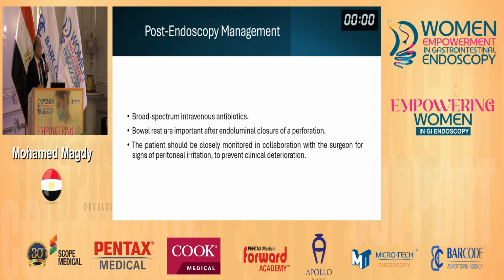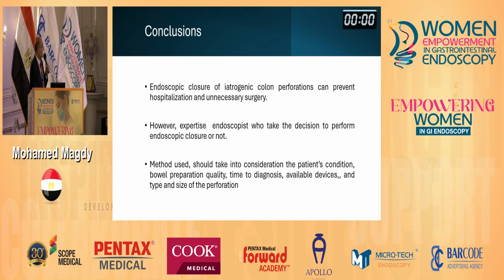Post-endoscopy management, of course, includes intravenous antibiotics. The patient should have good bowel rest and should be closely monitored. Conclusion: endoscopic closure of iatrogenic colonic perforation can prevent hospitalization and unnecessary surgery. However, expert endoscopists should take the decision to perform endoscopic occlusion or not, and the method should take into consideration the patient's condition, bowel preparation, diagnosis, available devices, and the perforation.